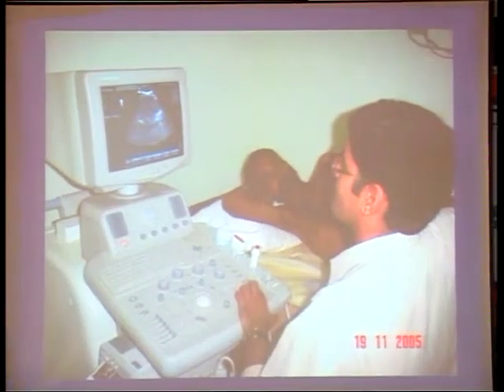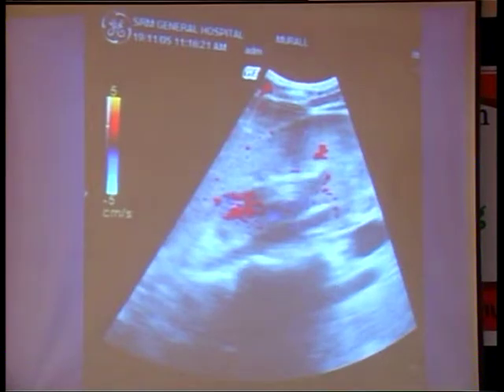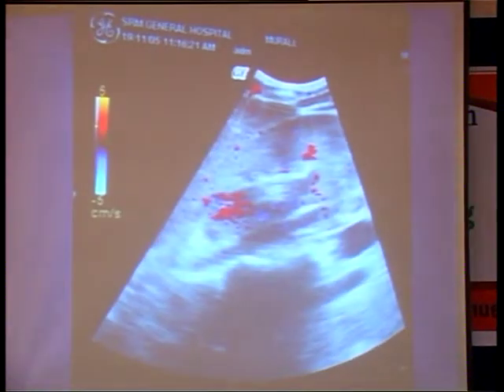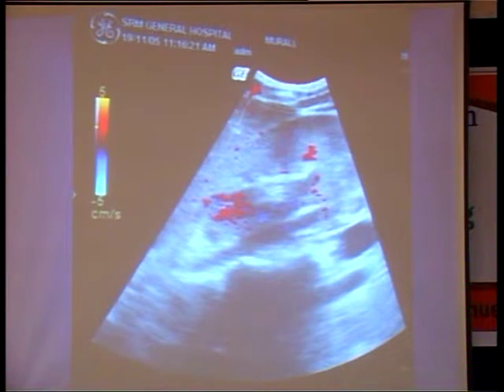This is the ultrasound machine. Now the color Doppler. Color Doppler has many uses. One is to say whether the arteries or veins are involved or not. If it is arterial, there is an atheromatous stage, and there may be a clot. If it discharges from there, it will go and affect the distal area and produce thromboembolic phenomena.